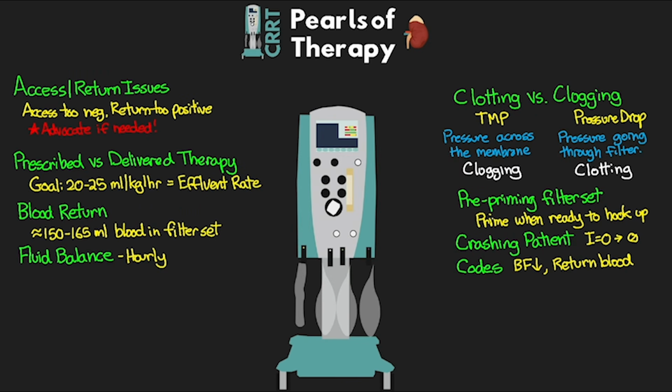Now, in the last lesson, we talked about the anticoagulation strategies for CRRT, so I do want to talk a little bit more here just about some pearls for our citrate anticoagulation. It's going to be important that you ensure that you're using dialysate and replacement solution with no calcium in there. The calcium that's in the normal premix bags can bind the citrate, basically making it less effective.